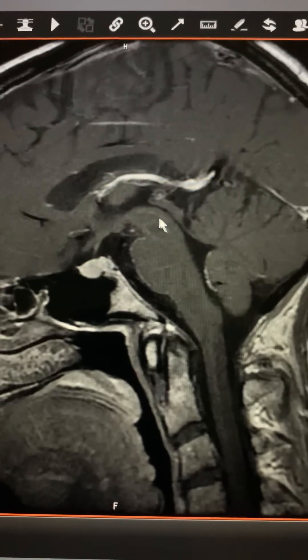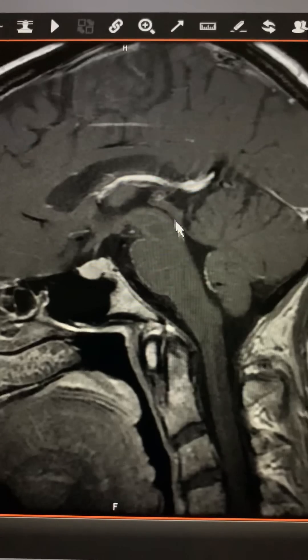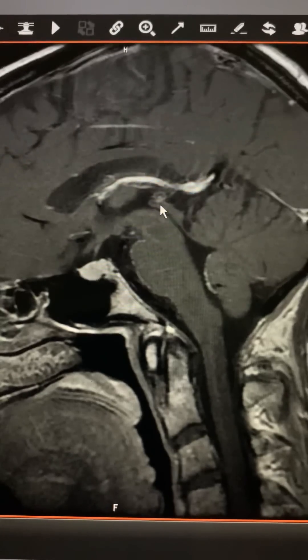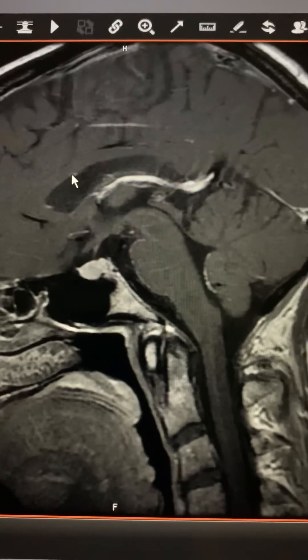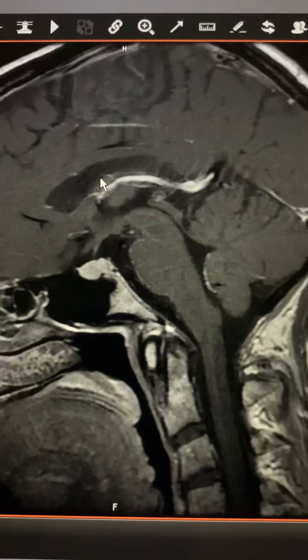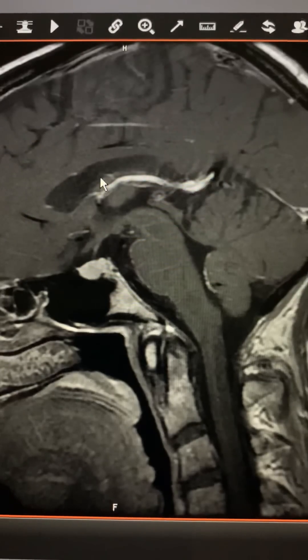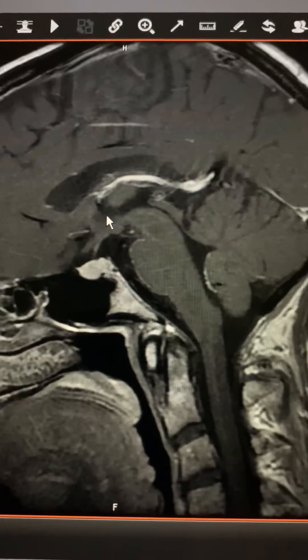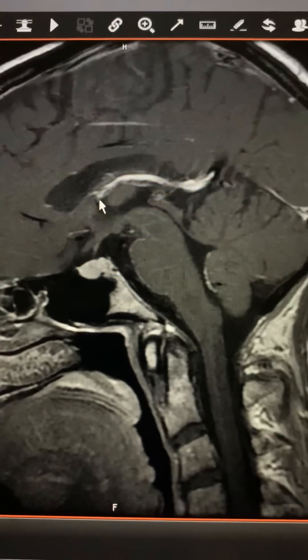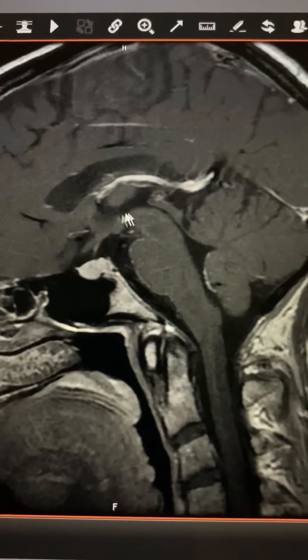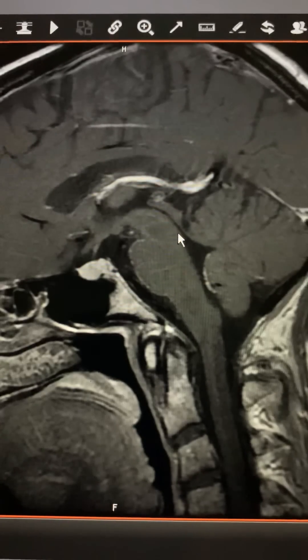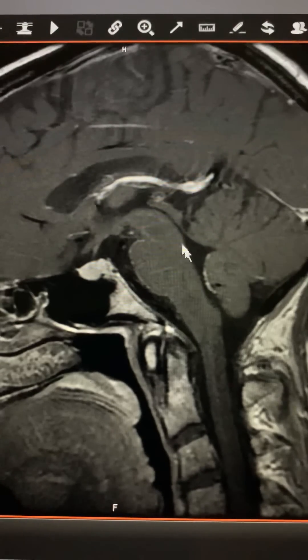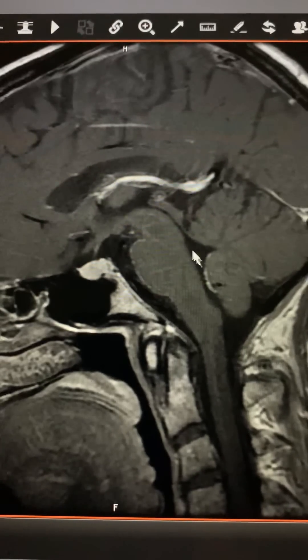This is the cerebral aqueduct of Silvius. It's a pipe in the brain that carries spinal fluid from the lateral ventricles where it's made, down through what's called the foramen of Monroe into the third ventricle, through the cerebral aqueduct of Silvius, and then into the fourth ventricle here.